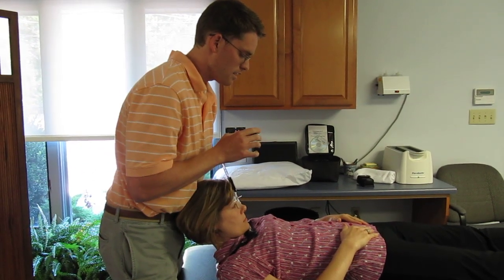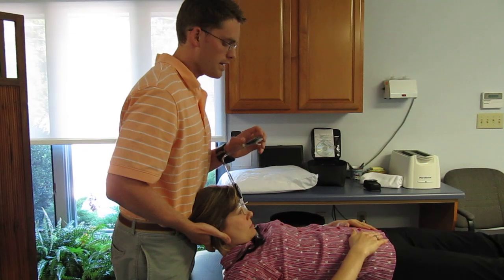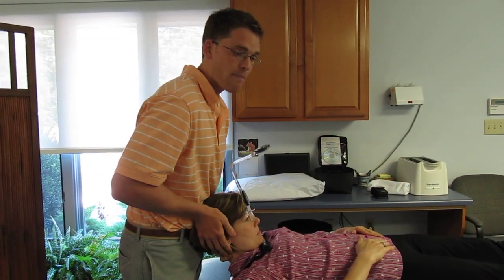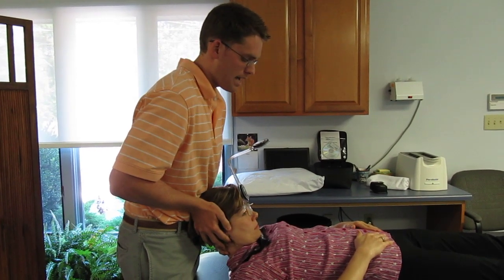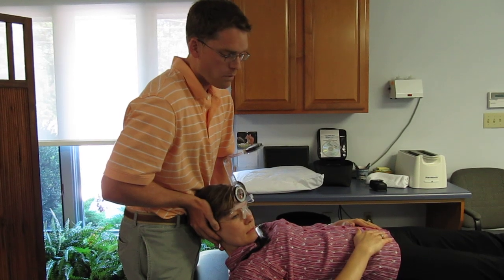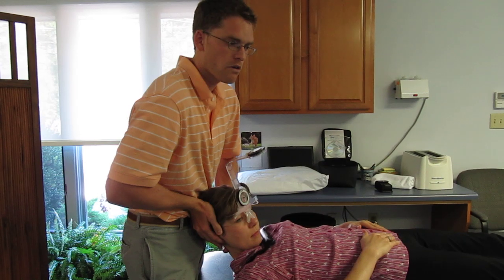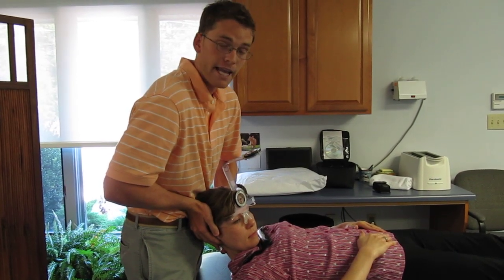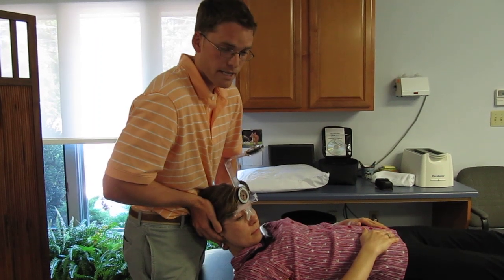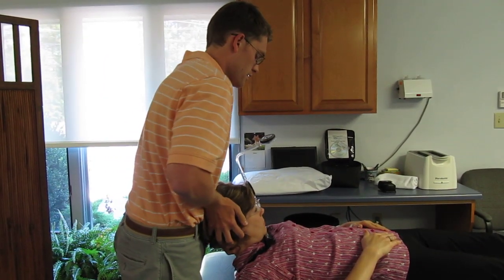From here you can rest the patient's occiput on your abdomen and zero the device. This is a passive test. You want to passively rotate the patient's head one way, and what you're feeling for is firm resistance, or you're asking if their pain arises. Whichever one comes first, that's going to be the degree you're looking for. And you're going to do the same thing to the other side.